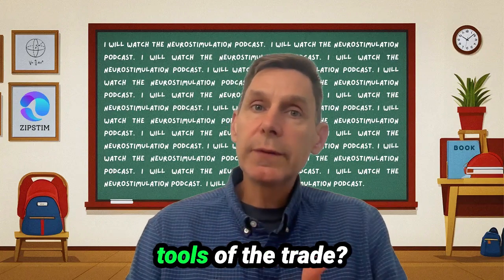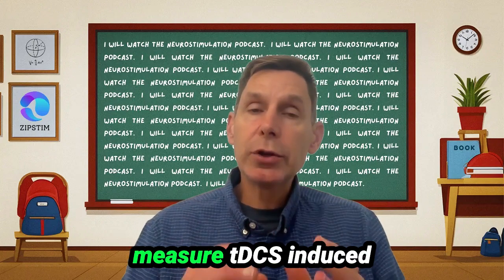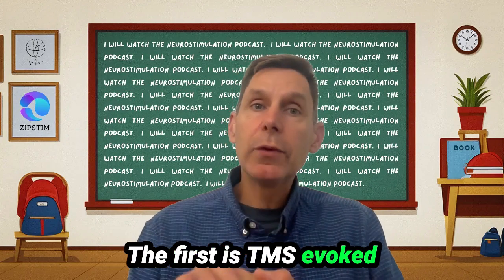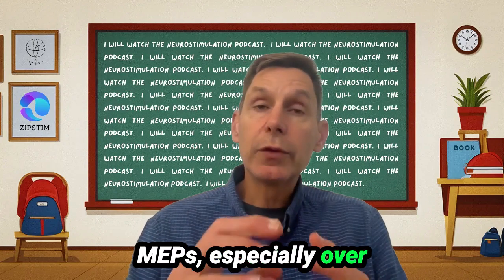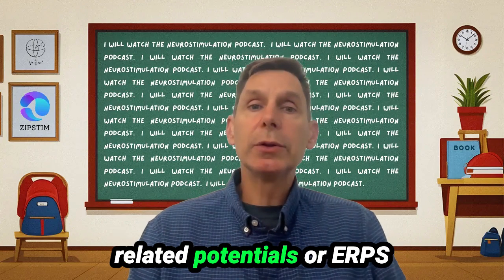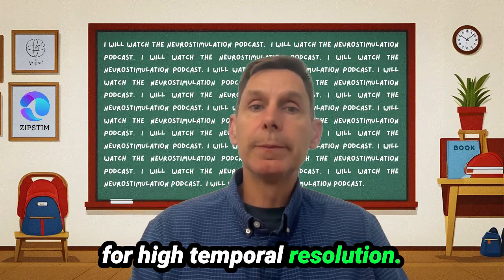So what are the tools of the trade? Let's run through the main methods used to measure tDCS-induced neurophysiological changes. The first is TMS evoked motor potentials, or MEPs, especially over the motor cortex. The second is EEG and event-related potentials, or ERPs, for high temporal resolution.